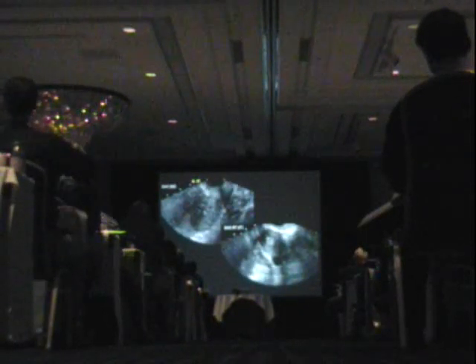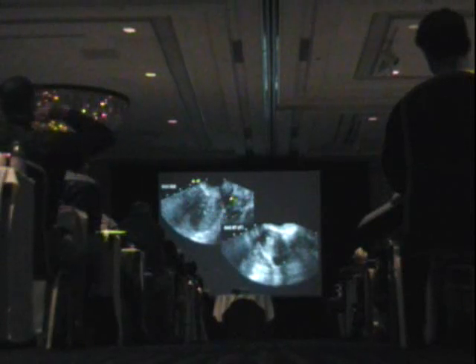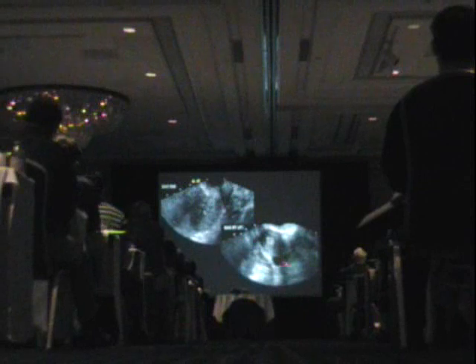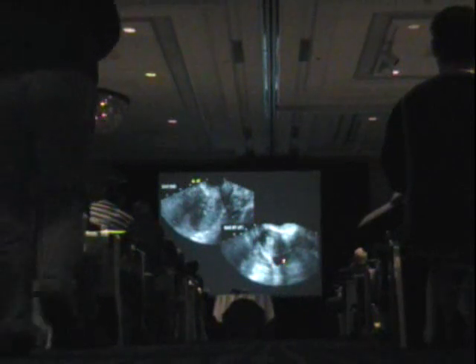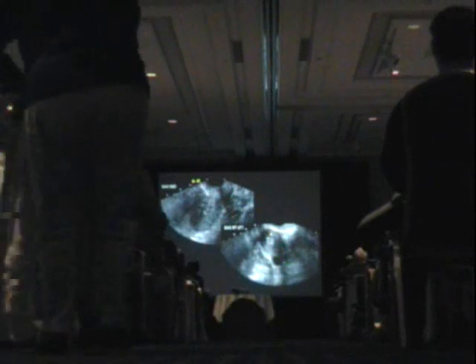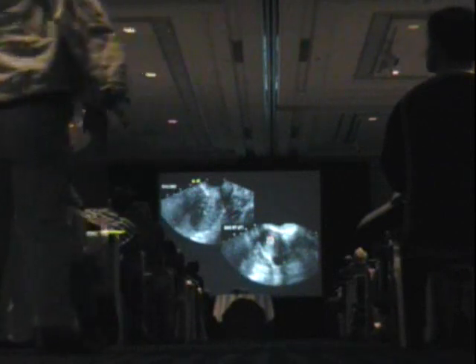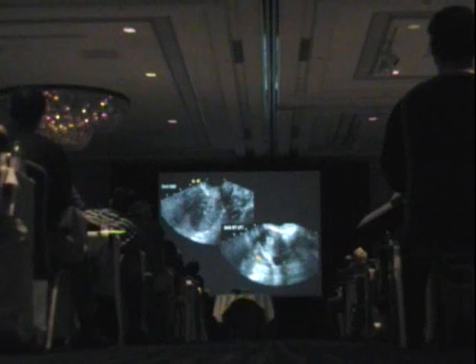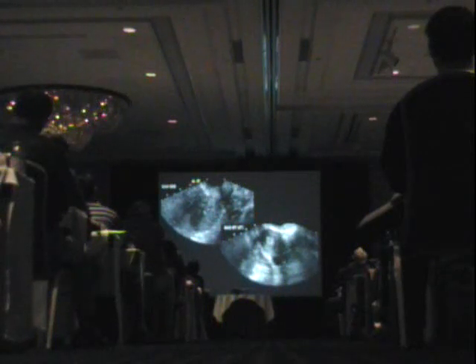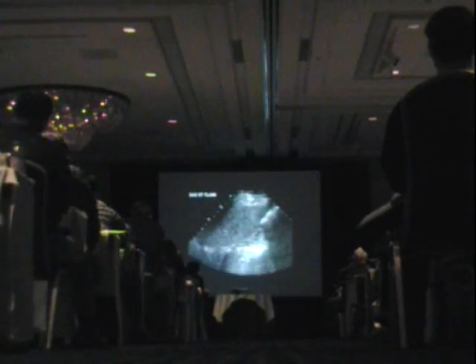Here's a patient who did have that anomaly. Here's her endometrium over on the left side. Her uterus was displaced to the left, but it looks like a reasonably normal uterus over to the left with the linear endometrium. But over to the right, sitting far lateral, here's the iliac vessel here. Way over to the right, we found this soft tissue mass separate from the ovary with a thick endometrial area in the center, and this was confirmed with MRI that there was a right-sided uterine remnant with a unicornuate left uterus.